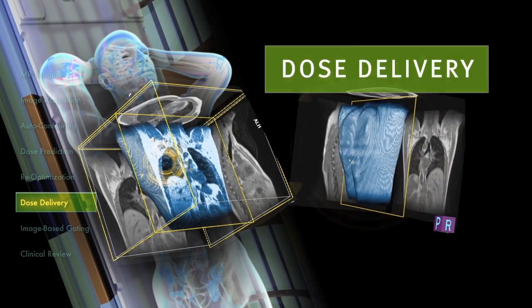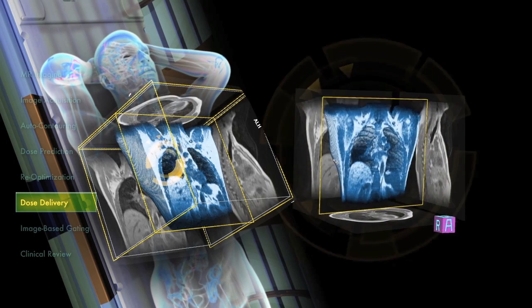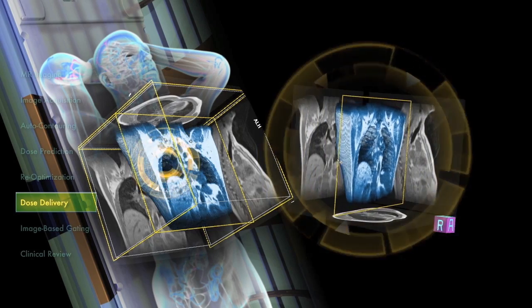Once treatment begins, the MRI captures a continuous stream of soft tissue images, every 250 milliseconds in a single plane and every 500 milliseconds for three planes.